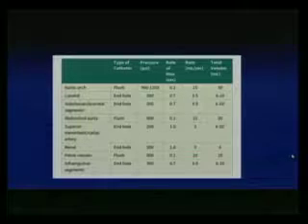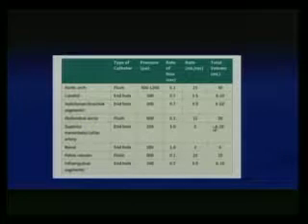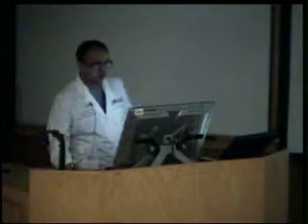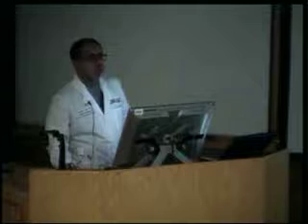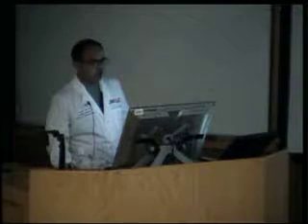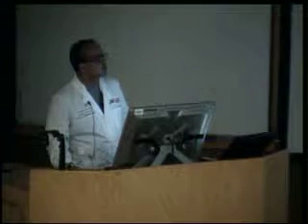So talking about the contrast, the rate and the volume. Let's go from top to bottom. In the aortic arch, usually it's by the injector. You inject contrast, and I usually use 15 ml per second for a total of 30 ml. Depending upon the patient's creatinine, you can use half strength contrast and dilute the contrast. So aortic arch is 15 for 30.